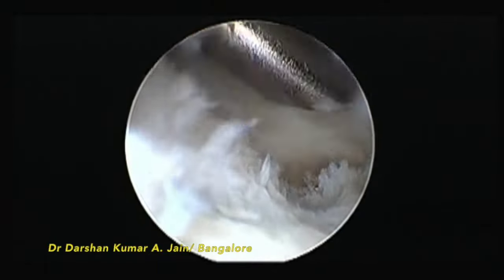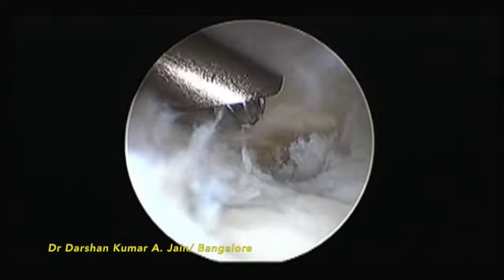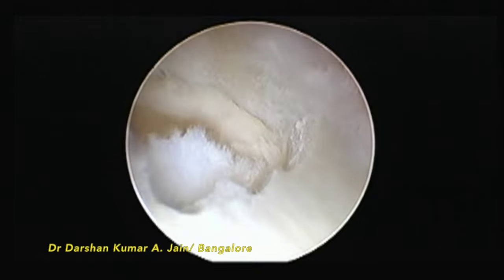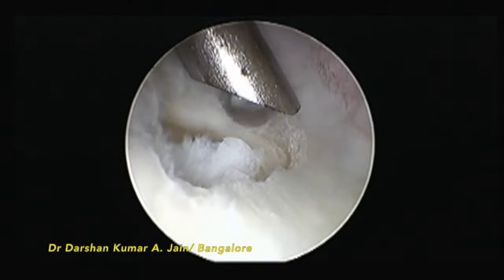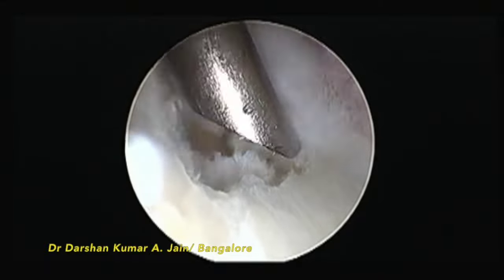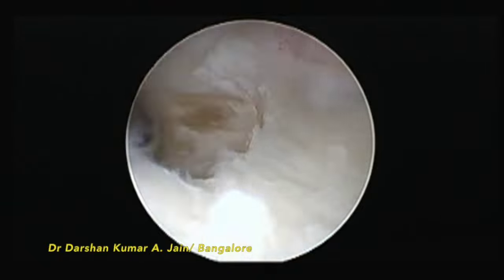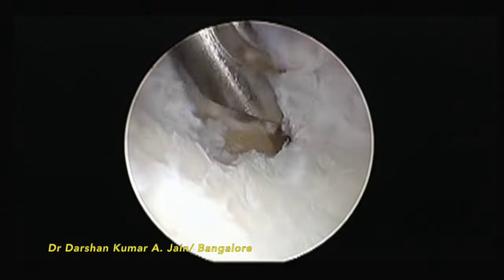One should not debride more than 4 mm, and care should be taken that the sigmoid notch is not damaged. Intraoperatively, one has to check whether the removal of the ulnar head is sufficient. A C-Arm can be used to check this.